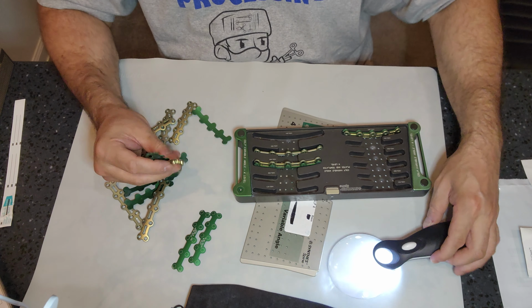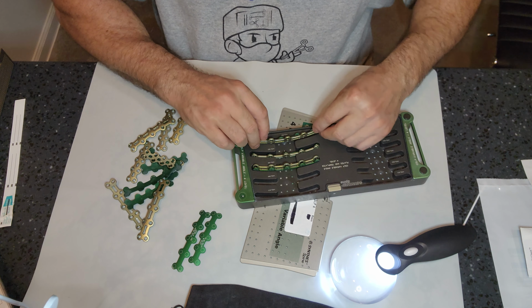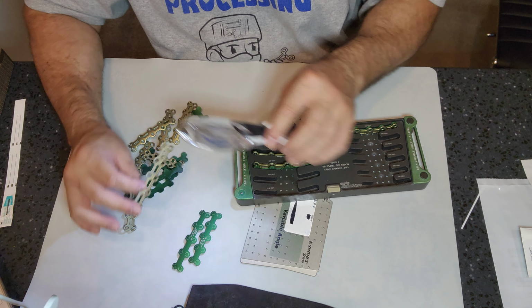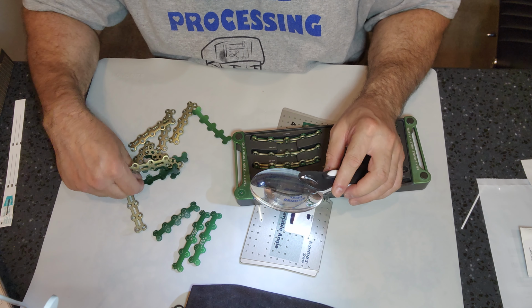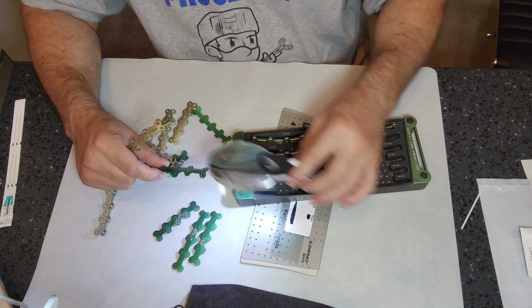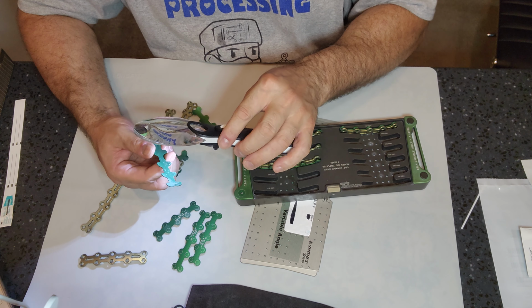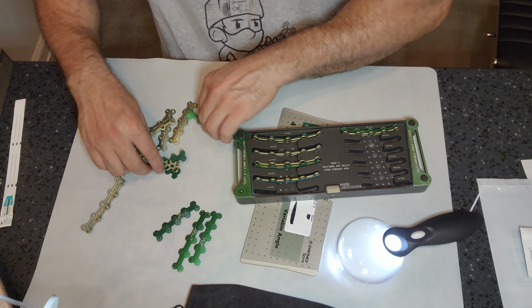Okay, this looks pretty clean. 191. My implant here is a 188, and I'm looking for a 188 trial. There's my 188 trial. I'm going to go ahead and inspect that for cleanliness. Looks good, and I'm putting it in the 188 slot.